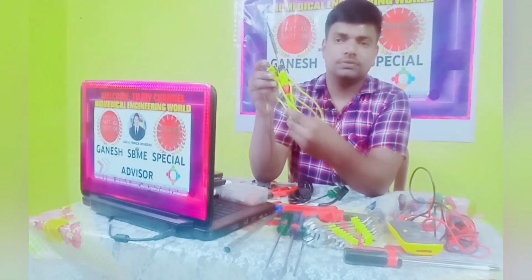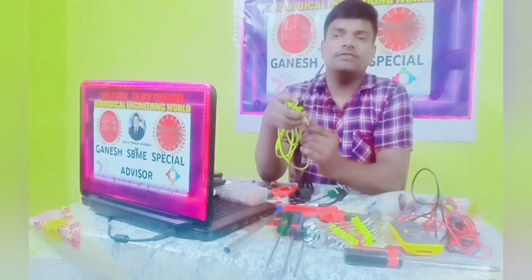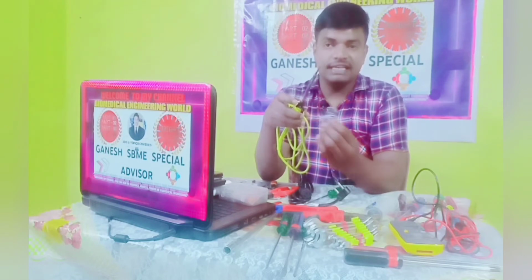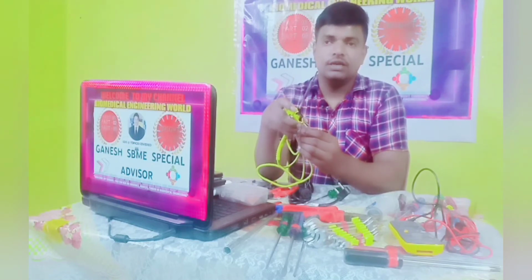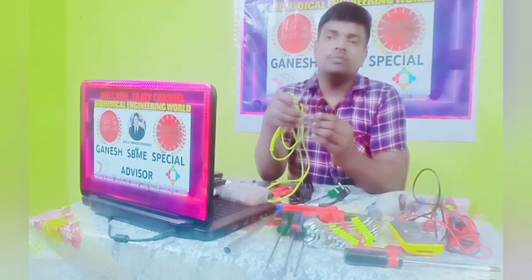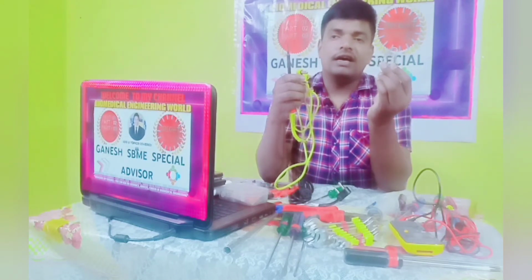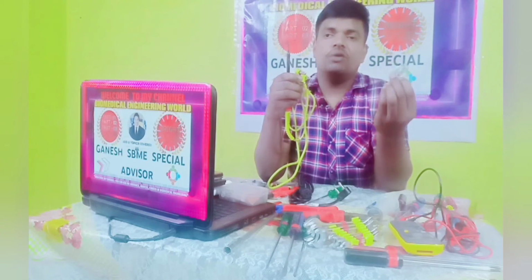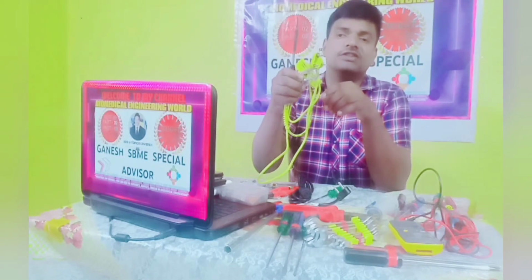soldering gun. Soldering gun and lead, these are the set for soldering. If wires need cutting, wires need jointing, or components need replacing, if you find any defect in the components of the medical devices, we can find and resolve the problem using the soldering gun. It lets us disconnect and connect wires, and remove and place components, especially in electronic devices.